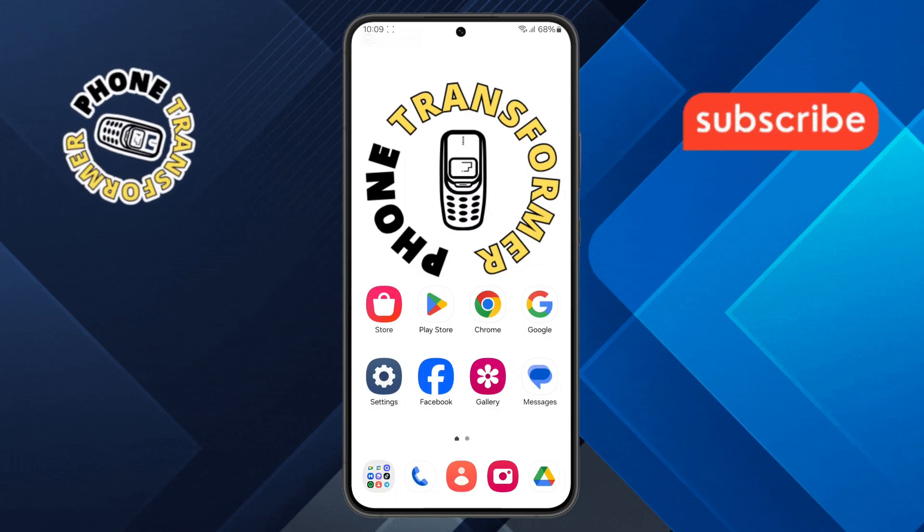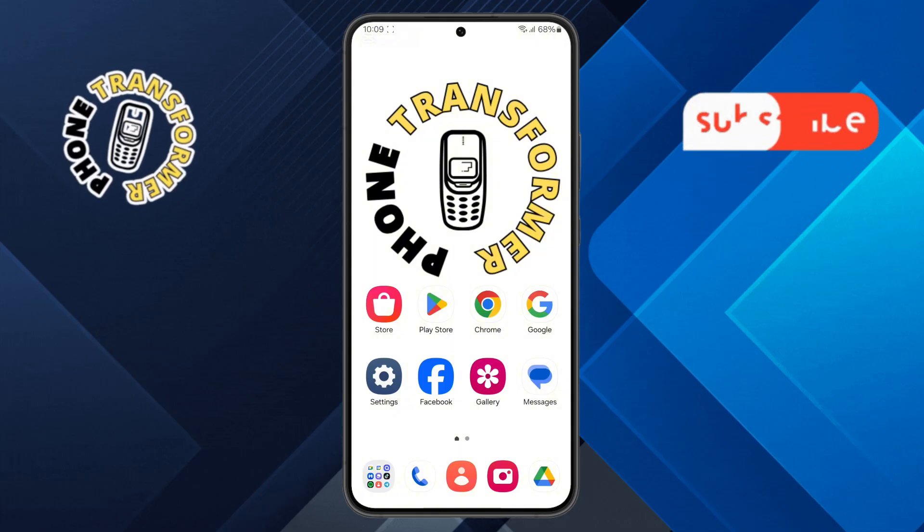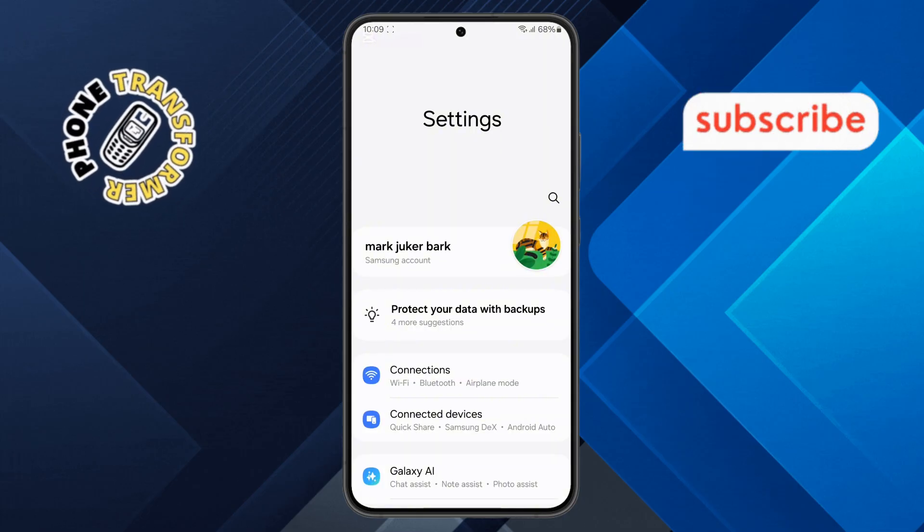Step 1. First, grab your Samsung Galaxy device and open the Settings app. You can find it on your home screen or in the app drawer.